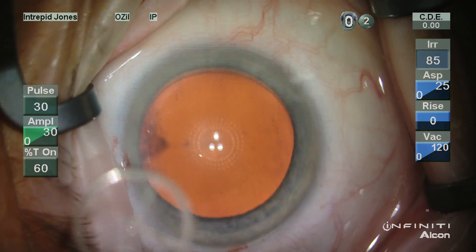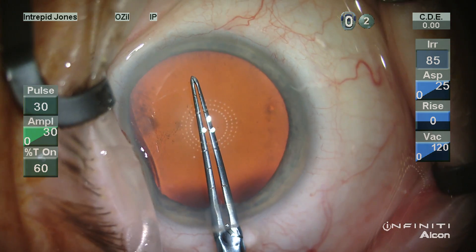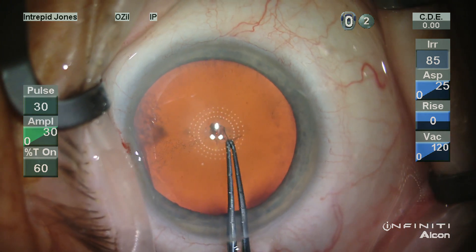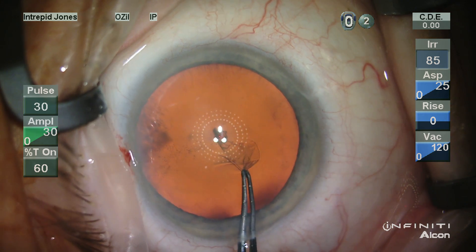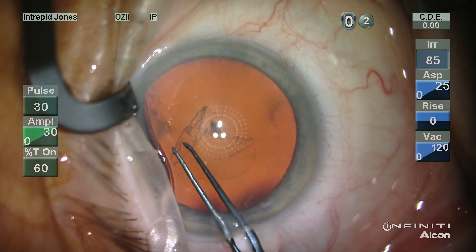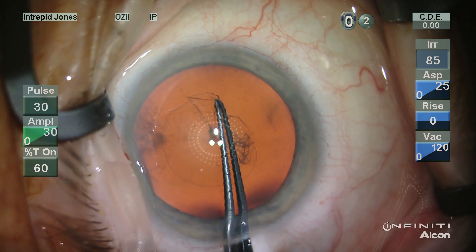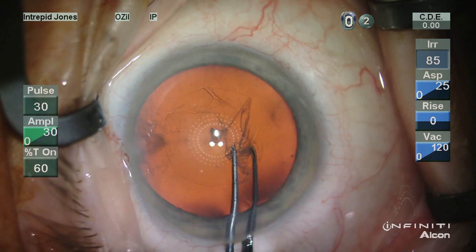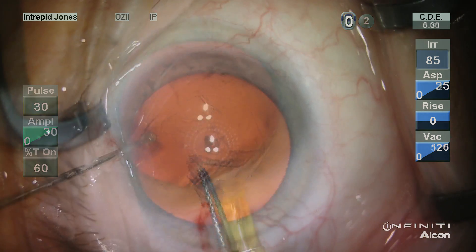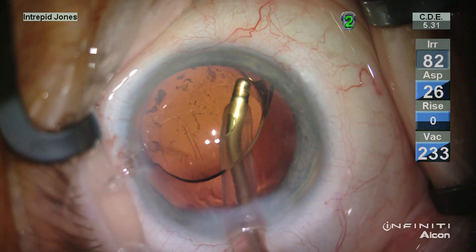Here's another application which is fairly common. The patient is asked to fixate on the blinking beacon. The marker is applied and the utratas are used routinely to assess for corneal magnification using the inscribed one millimeter marks which go out to six millimeters along the backbone of the jaws of the forceps. This allows a very consistent sizing as well as shape of the capsulotomy, and the patient is able to maintain good fixation through this maneuver.